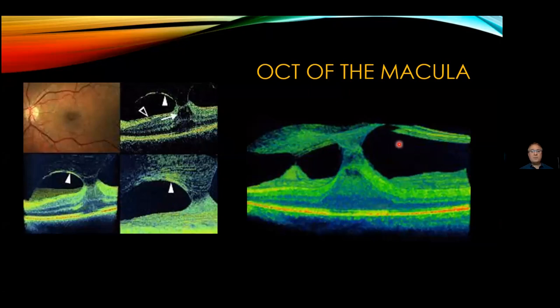Before I started my practice, we only had the ability to do fundus imaging and examine the retina with a direct and indirect ophthalmoscope and with the slit lamp. With the slit lamp's design, the beam of light is supposed to help you have a three-dimensional view or get a linear view of structures in the eye. But as we all know, if you don't have a well-dilated pupil and a very patient patient, evaluating certain structures in the retina with the slit lamp is and always would be difficult.